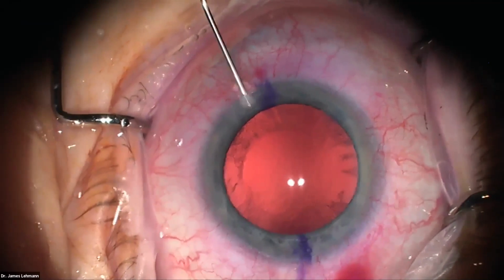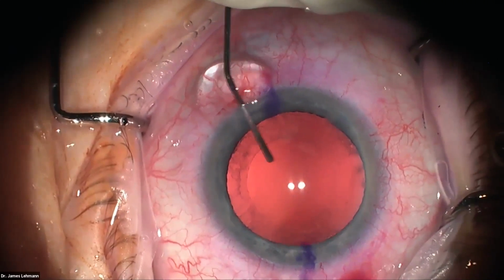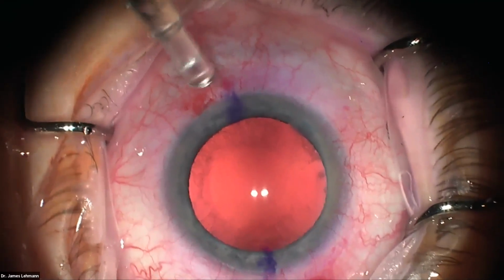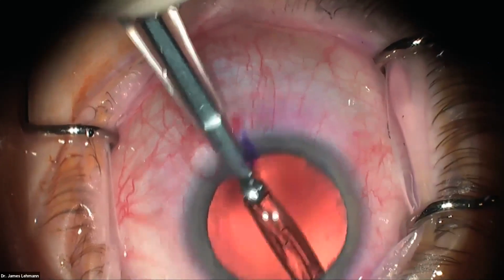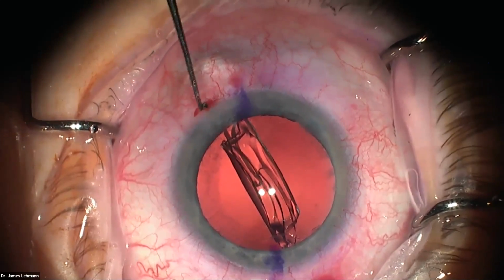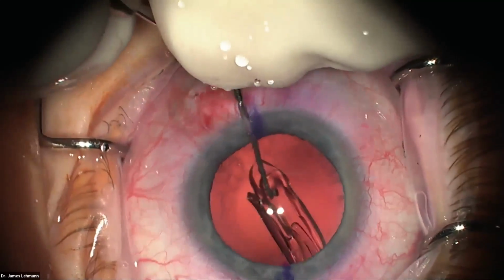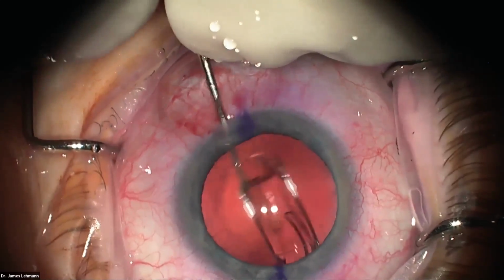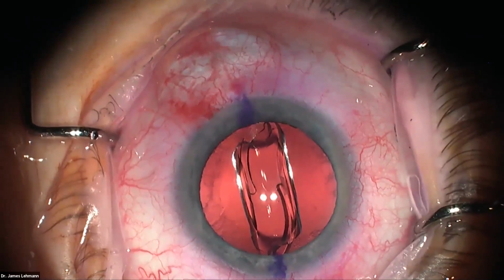Here's my cohesive viscoelastic. I'm going to augment the size of the capsule there, get my lens centered here, and then inject. And now using this Kuglen hook, like I said, just get that trailing haptic in the bag, get it centered, and then snap at the haptics here, make sure they're not stuck. And then just a waiting game a little bit to let that thing expand.